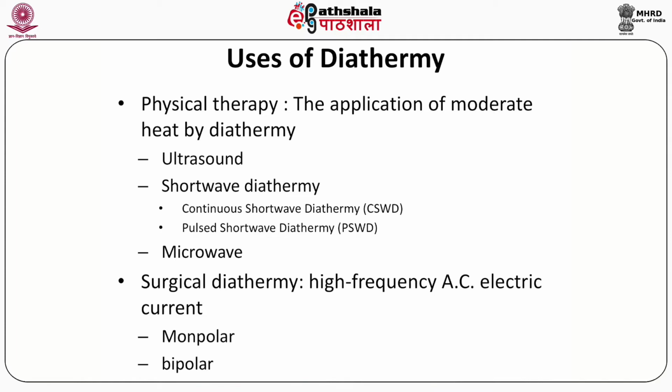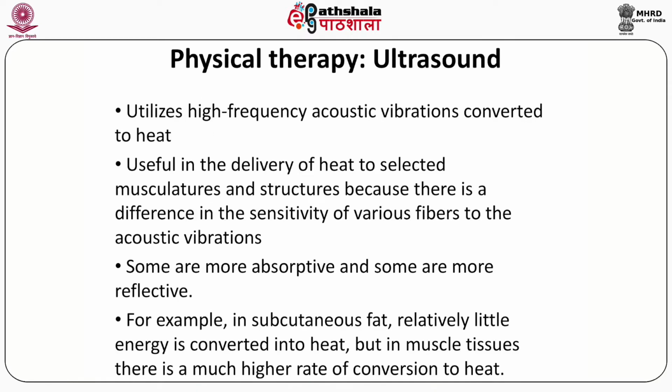Coming to the surgical diathermy, that is the use of high frequency alternating current, AC electric current, and it has mainly two modalities, monopolar and bipolar, that we will talk about in detail later. Coming to the first use of diathermy, that is physical therapy, the first modality is the ultrasound. So first we will talk about the ultrasound.